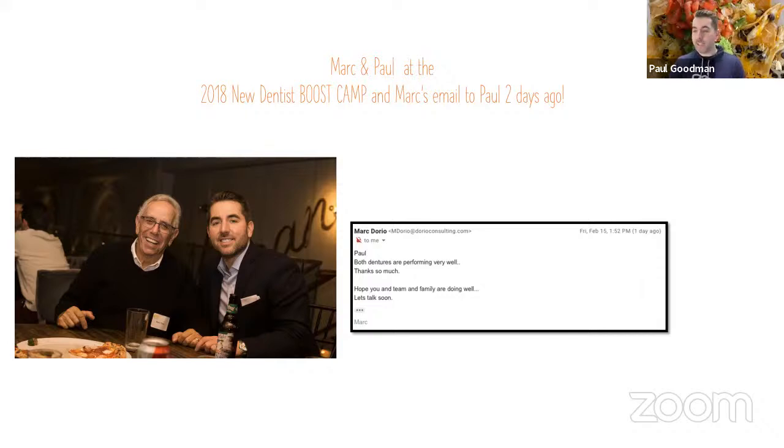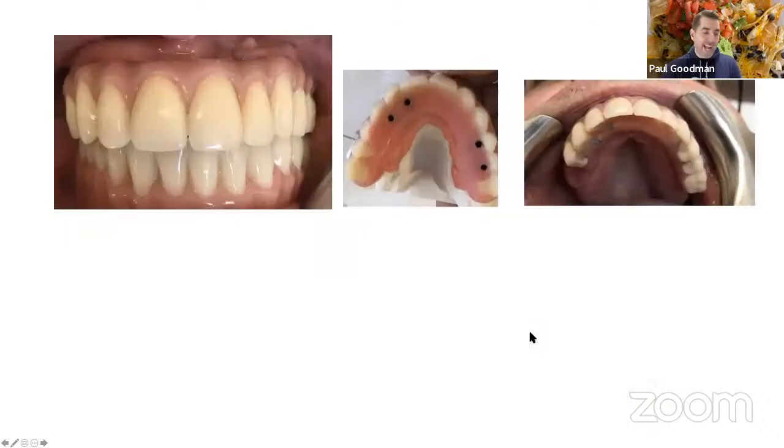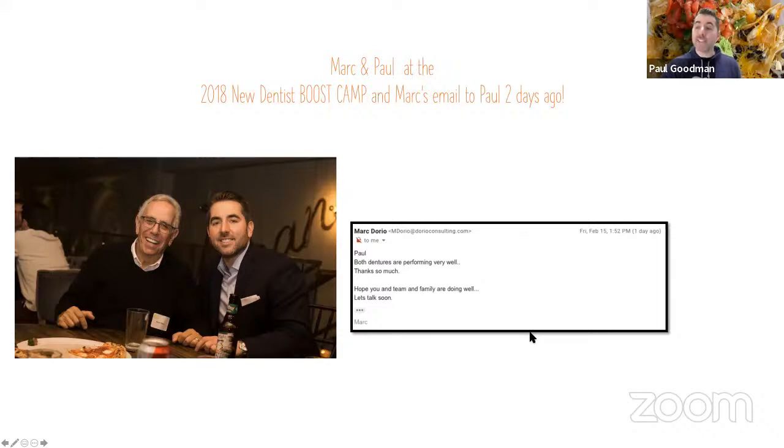But when you manage people's expectations, both clinically and business-wise, as you could see here, my periodontist and I noticed, look at the lower right. Here's an extra implant. Look at the lower left. Here's an extra implant. So before the case totally failed, which we don't say failed, before some implants needed to retire and be replaced, we were putting in extra bone savers that we knew we would need one day. So we were strategically adding more implants to this case so the patient would have something to function with later. Manages expectations the whole time.